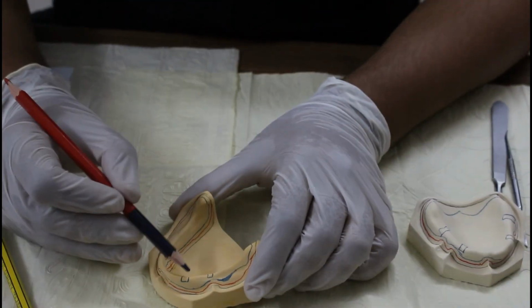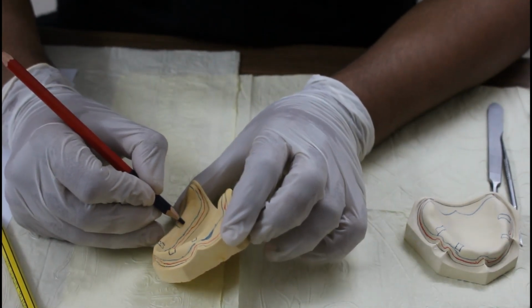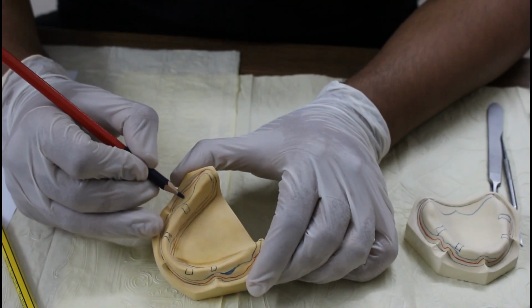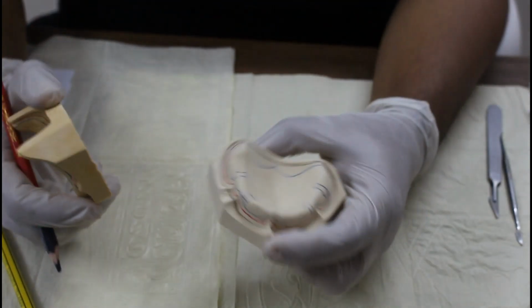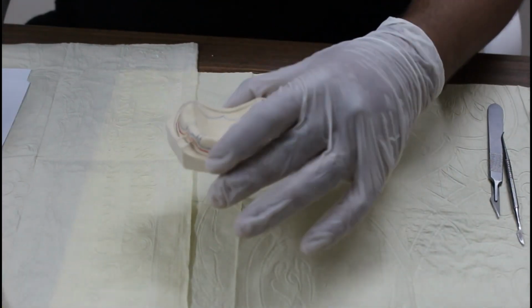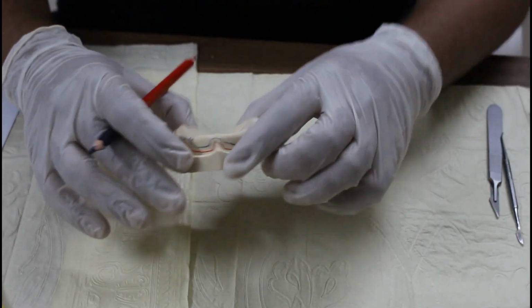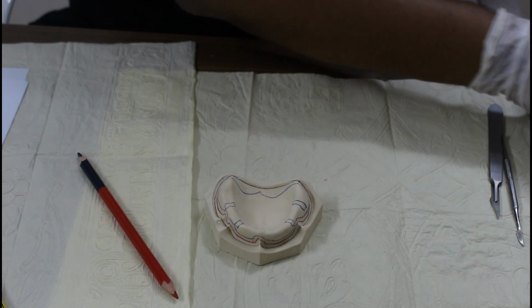So it's your wish. You can make only 2 or you can make 4, as you want, because this area is also acting like a tissue stop area. Once you do this much, show this to your supervisor, then we will start fabricating the tray. Now, first step in fabricating the tray is to make a spacer.